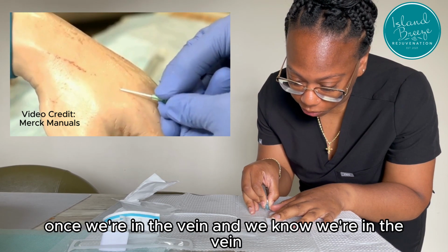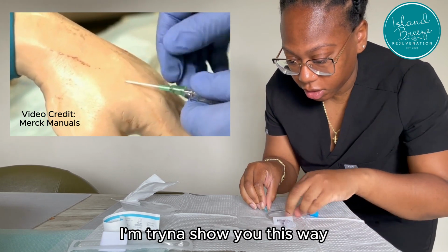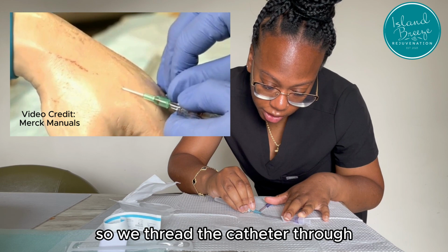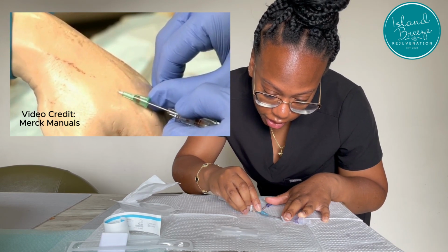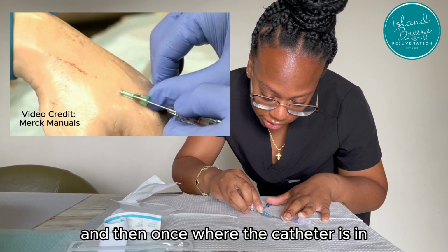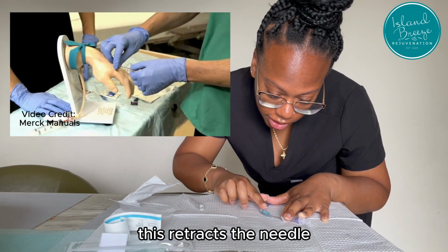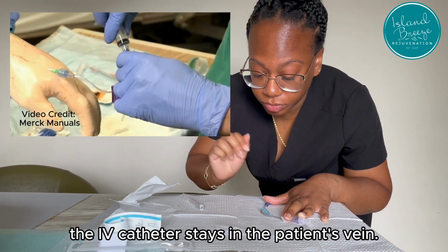Once we're in the vein and we know we're in the vein, we thread. I'm trying to show you this way and also be in line with the vein. So we thread the catheter through, and that's in the vein. And then once the catheter is in, we press this button here. This retracts the needle. The IV catheter stays in the patient's vein.